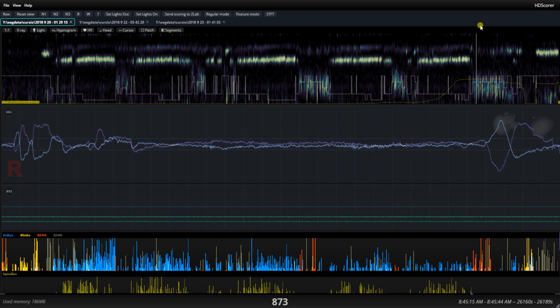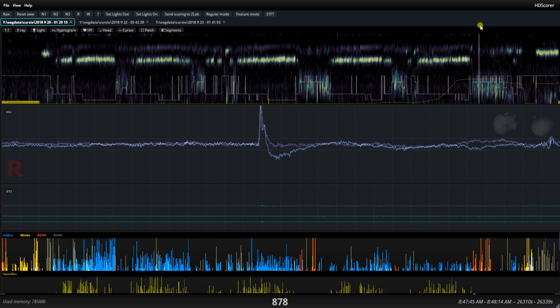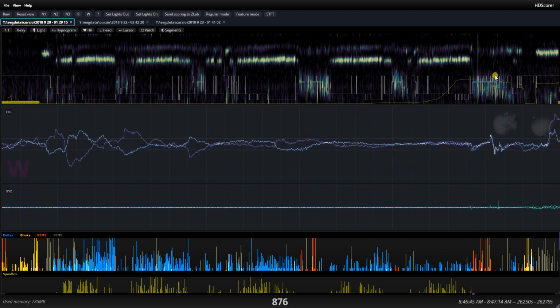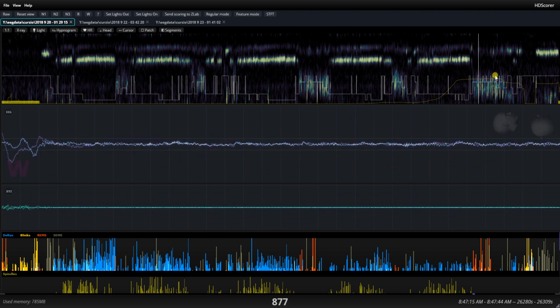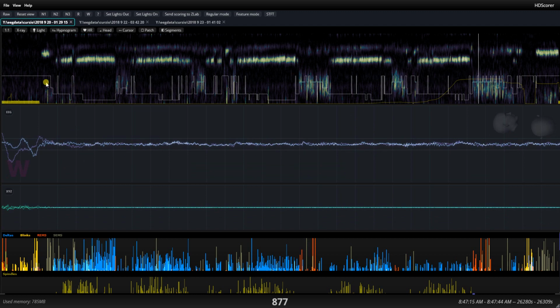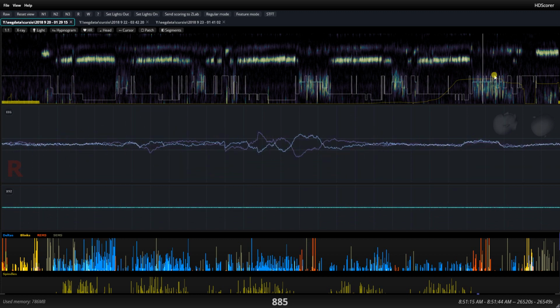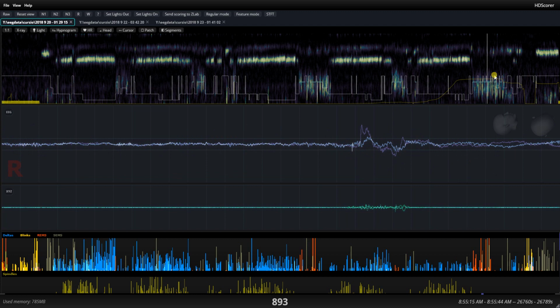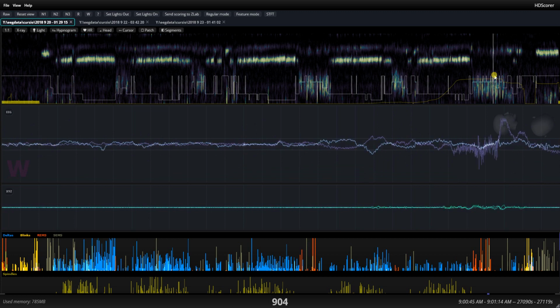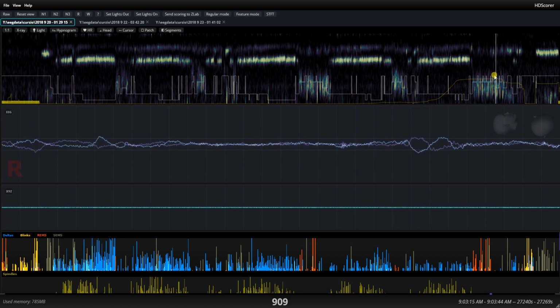So the way I'm scoring wake, as I was saying before, it's prone to showing all kinds of wake peaks on the hypnogram. Now that's a preference. I'm still waiting for feedback as to whether people want this or don't want this, but to me, to have big movements marked as wake makes a lot of sense, because I want to see how many of them I had. For example, I had a lot of such movements and awakenings throughout the night compared to other people, and that's some salient information, so I don't know why you would ignore them. So this is basically a bunch of REM epochs with some wake periods in between when there are twitches, body movements, and all of that.